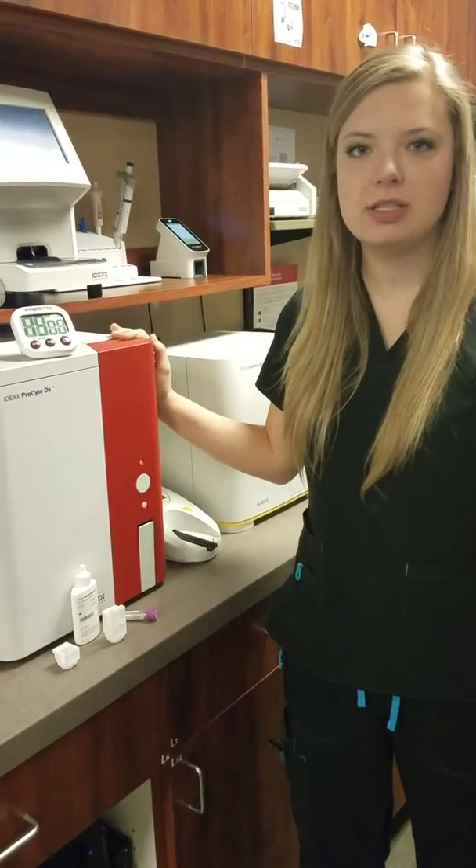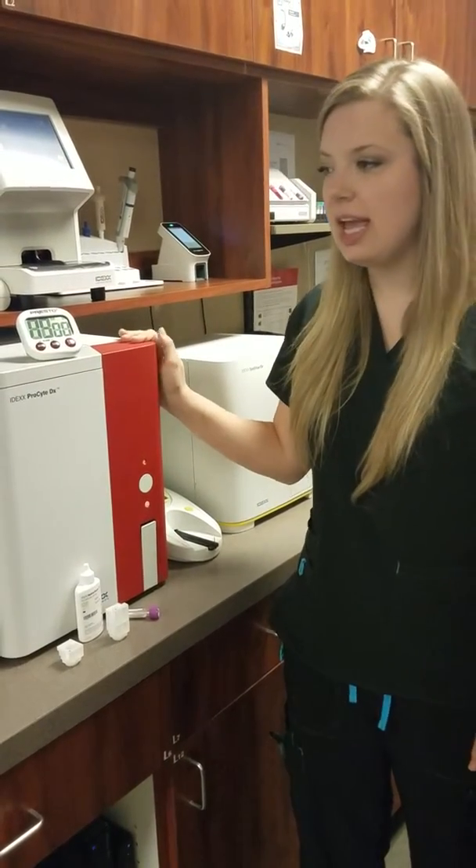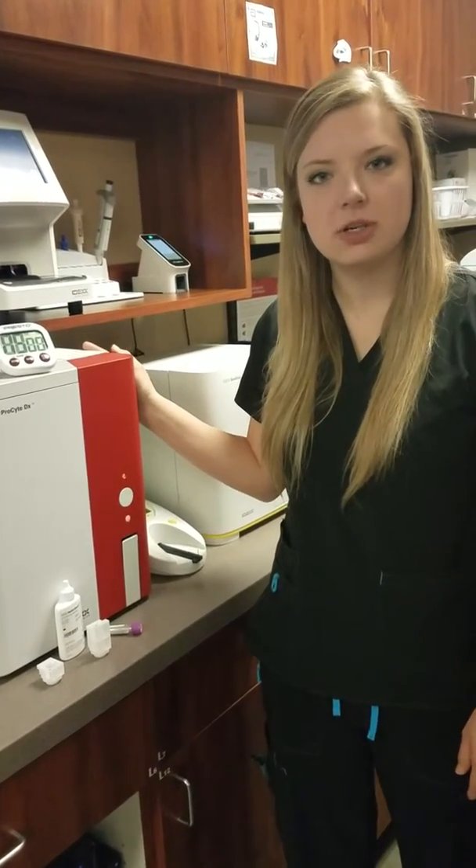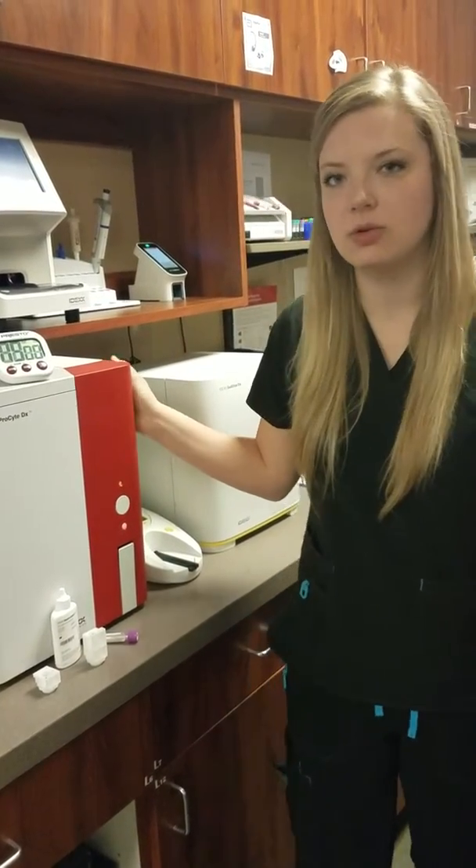This is our ProCyte machine. We run all of our CBCs on this machine, and we are going to do a monthly rinse and a quality control to make sure that our machine is functioning properly and that we get accurate results.